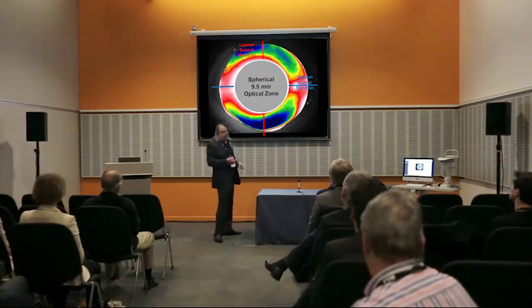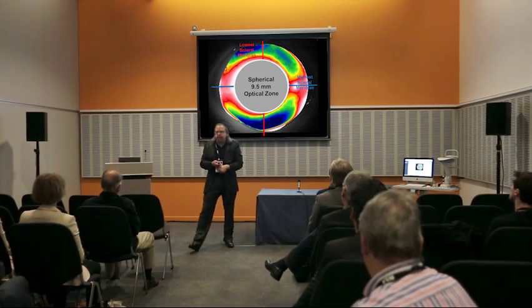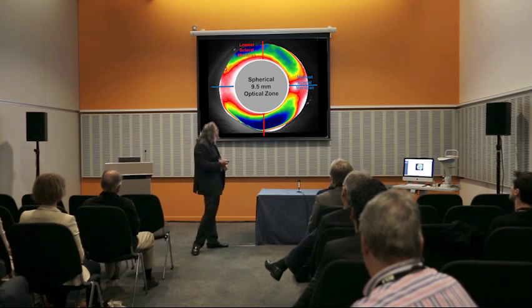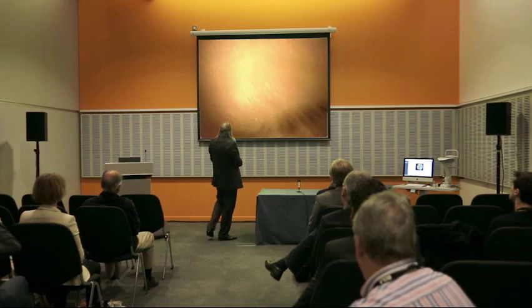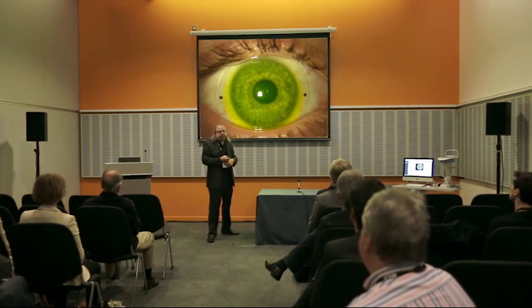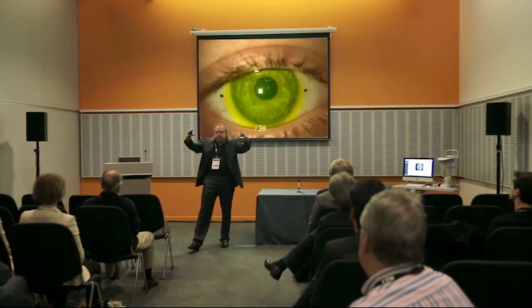Now, the other thing this has really helped me explain to the students is why toric soft lenses may not position where we originally want them to go. We want that marker to position at 6 o'clock, indicating that the cylinder axis is at the position labeled on the foil pack.